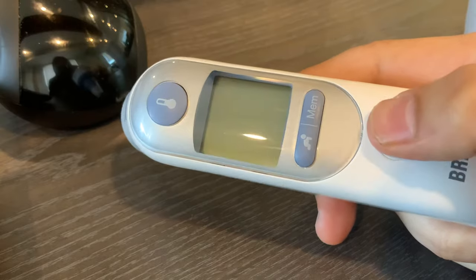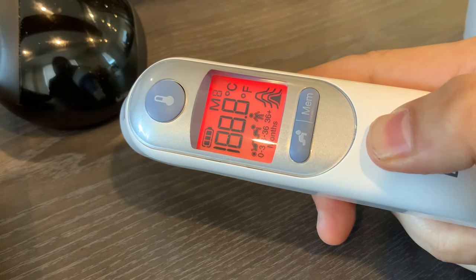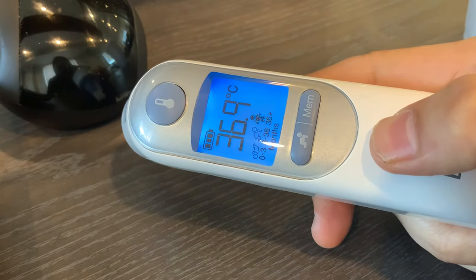I want to change it to Celsius this time. So I'm gonna hold this button and it's gonna rotate — F... and C. There we go, back to Celsius.